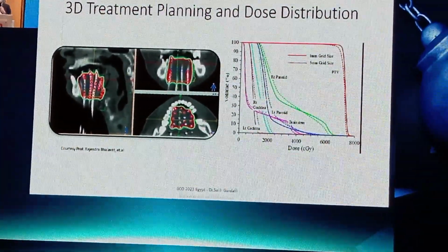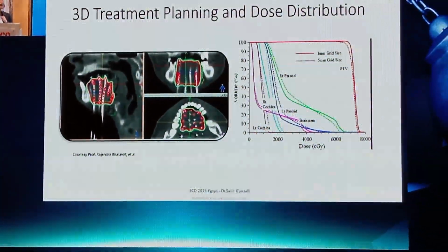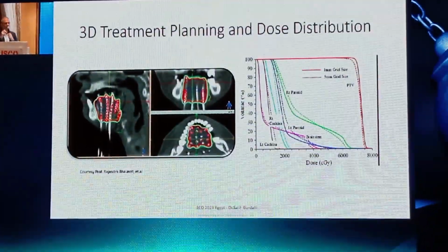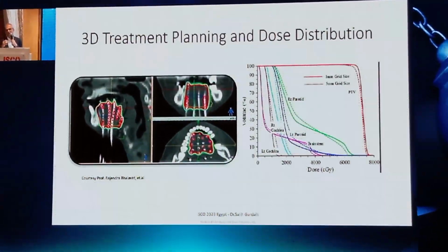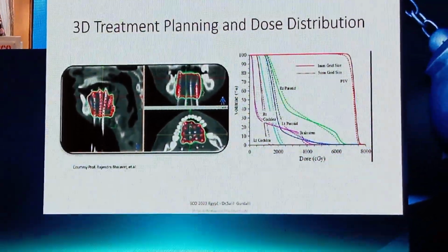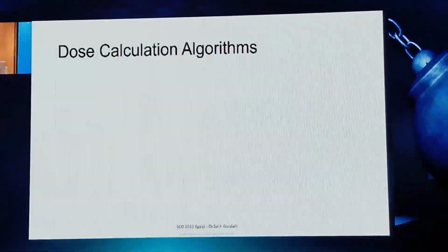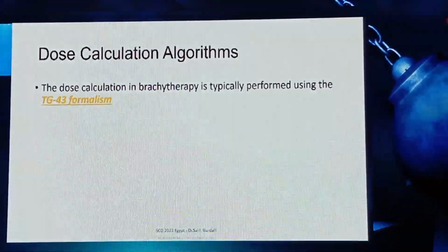All the volumes are in front of you. You even have a chance to have great differences. If you want, you can get a 5 millimeter grid calculation. If you want, you can get a 1 millimeter grid calculation, which is much more precise for you. So we have 3D planning systems, correct?